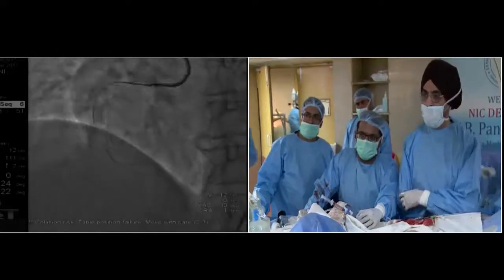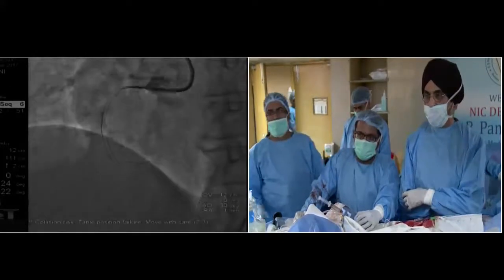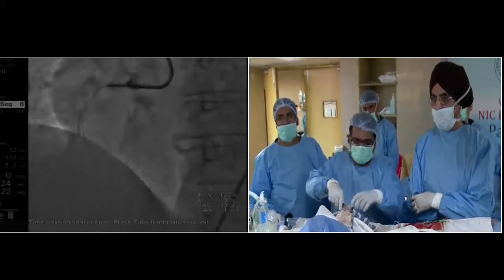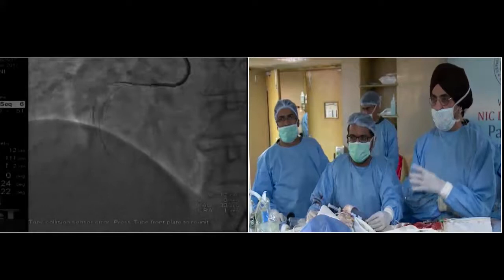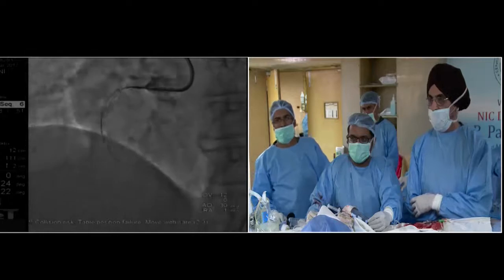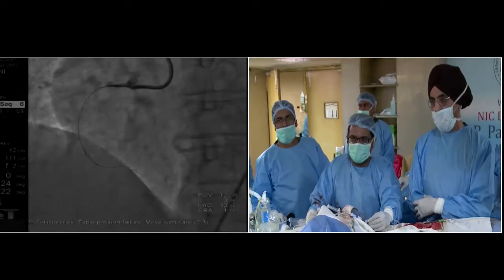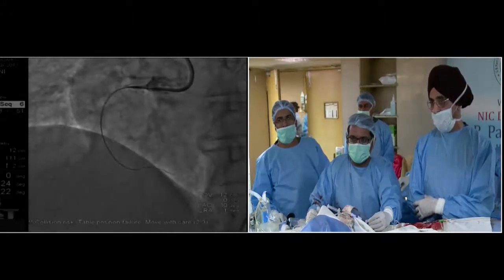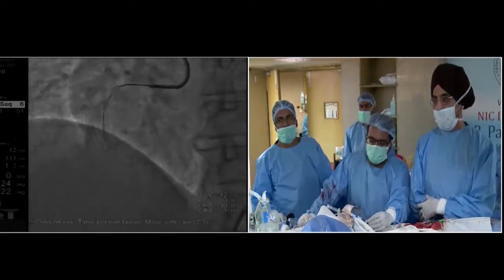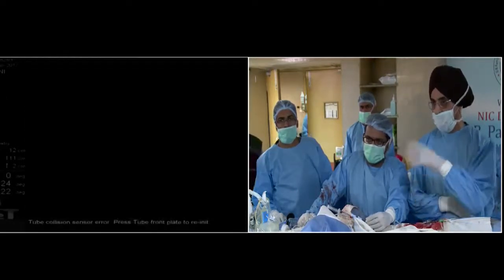But I had a 1.25 into 6 millimeter balloon. It did not cross the proximal lesion, with a guide which had reasonably good support. As you see, there's a lot of calcium in these vessels. So it was highly fibrotic, and a 1.25 into 6 Legend balloon did not cross the proximal lesion. I didn't have any other further techniques to help get my balloon across. So I think we leave it for the second sitting, and we went for the left side.